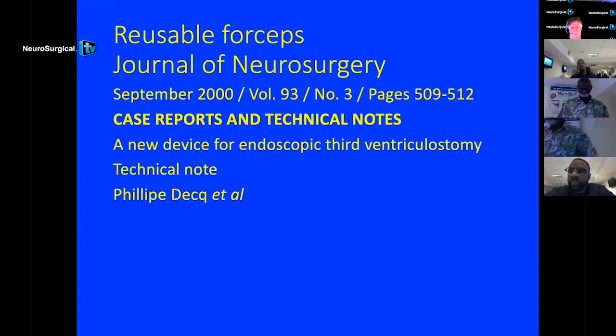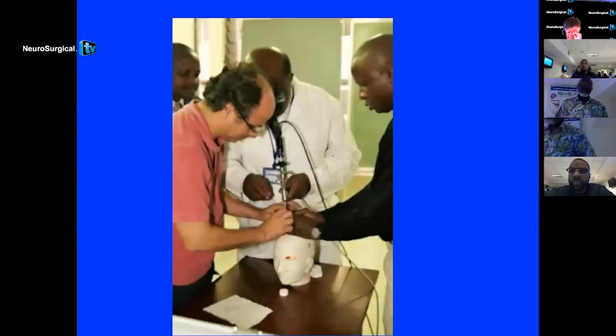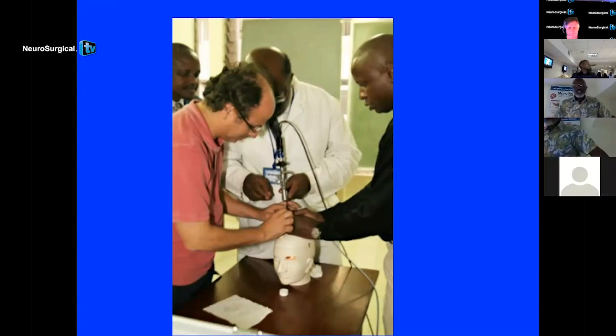Now, in Kenya, we had a watershed year in 2006 because a group of us went to the IFNE in Lyon, France. We met José Piquet and Shizuo Oi. There we see José Piquet with one of the first courses we had here. We used the Oi endoscope, and you can see how, in terms of utilizing it, some of the things that we worry about is a free-handed technique has to be stable. Now, there are actually three neurosurgeons who were watching José Piquet to stabilize it.